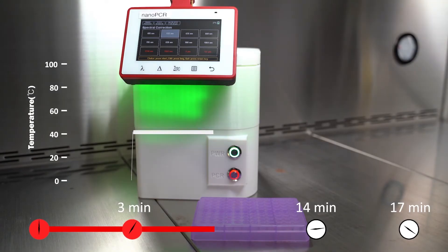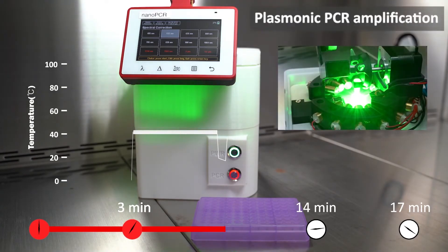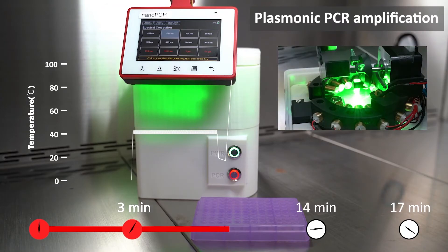In addition, the nano-PCR machine weighs only 3 kilograms and is very compact in size, which allows the device to be portable.